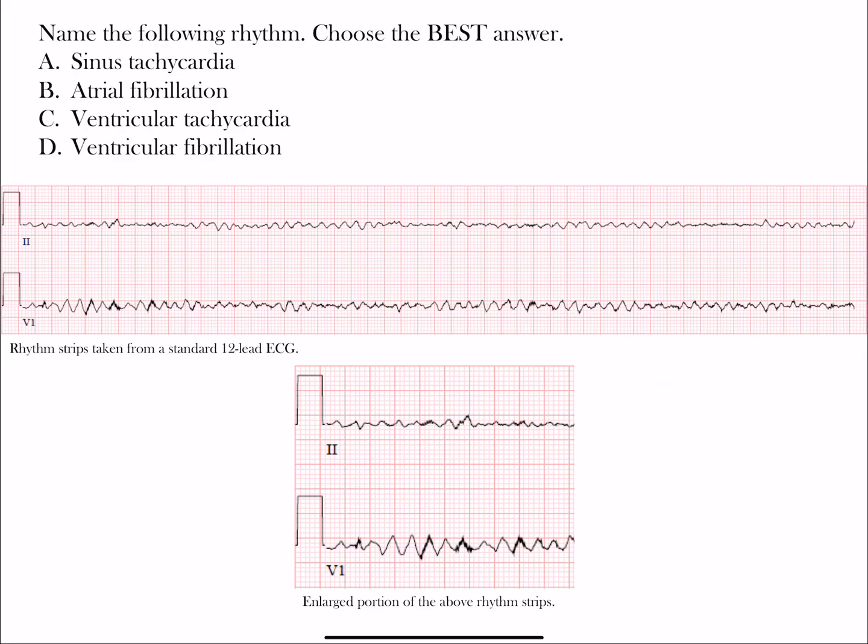Welcome to rhythm challenge. Here's our next rhythm challenge and as you can see we have two leads present. You have to choose the best answer from four different choices: A) sinus tachycardia, B) atrial fibrillation, C) ventricular tachycardia, or D) ventricular fibrillation. Take a look at the rhythm strips, choose the best answer, and when you're ready, restart the video.